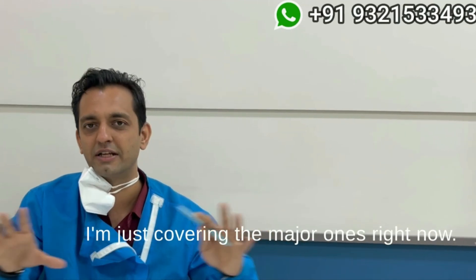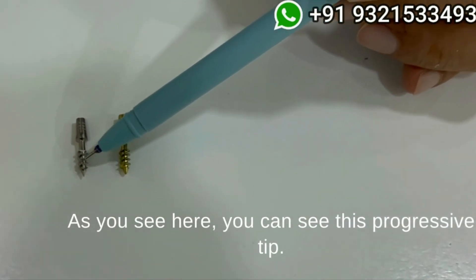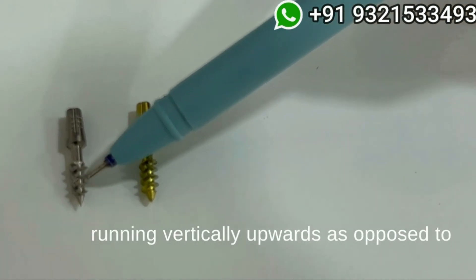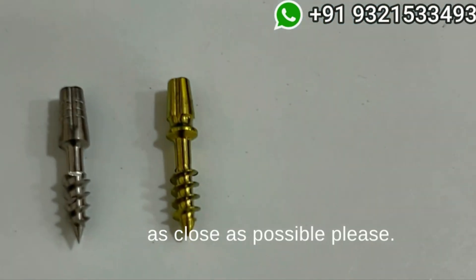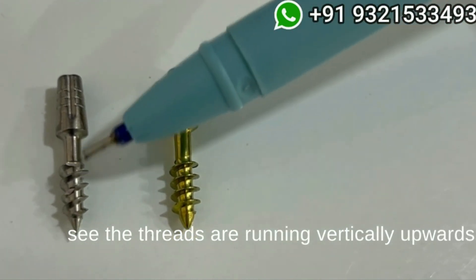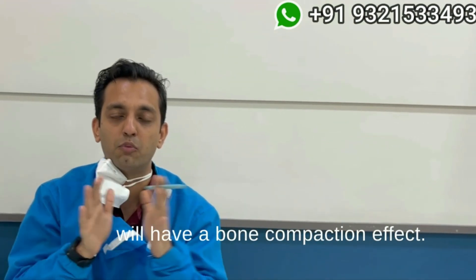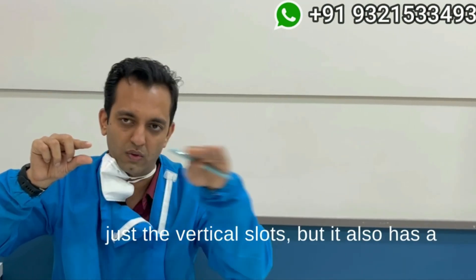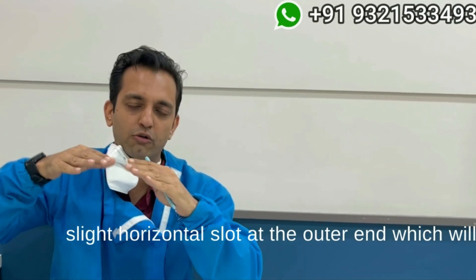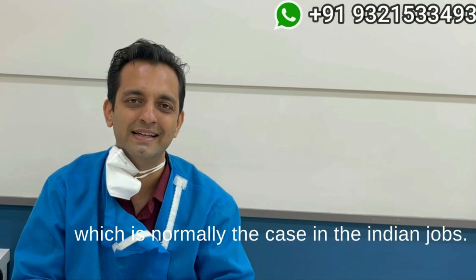Covering the major design changes: the second feature is this progressive tip — you can see the threads running vertically upwards as opposed to running horizontally in the implant. This will give you very high torque because of the aggressive design and it will have a bone compaction effect. These threads also have a horizontal slot — what you see with your naked eye are the vertical slots, but there is also a slight horizontal slot at the outer end, which gives very nice torque especially for pterygoid implants and areas where bone is soft, which is normally the case in Indian jaws.